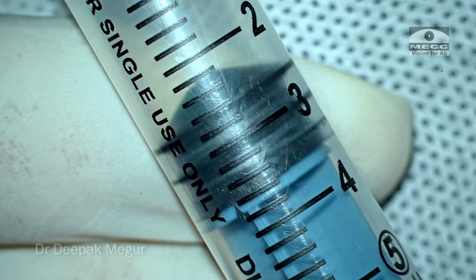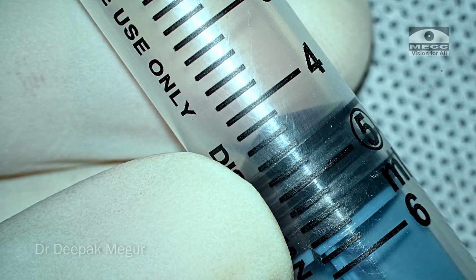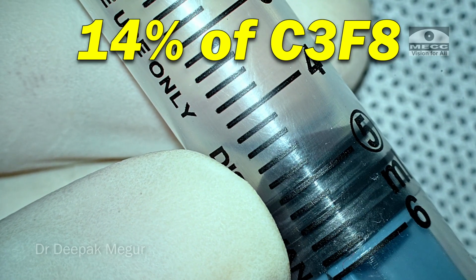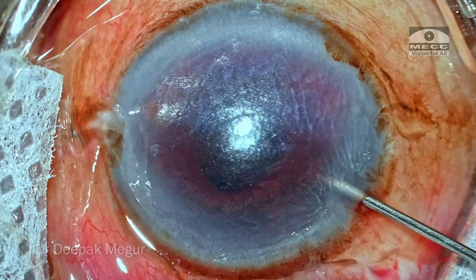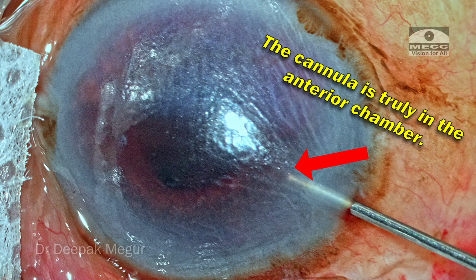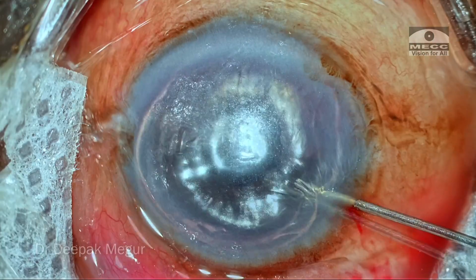So 0.7 ml of gas in a total volume of 5 ml gives rise to a concentration of 14% C3F8, which is thought to be isoexpansile, and I'm going to use that concentration here. The cannula is placed well within the anterior chamber before inflating it. Once I'm certain that the cannula is inside, the gas is injected into the anterior chamber.